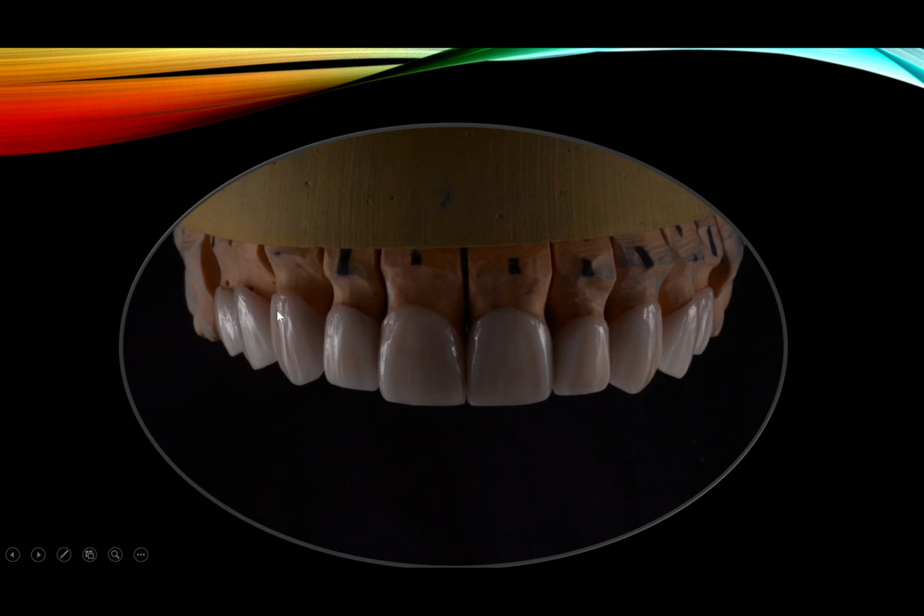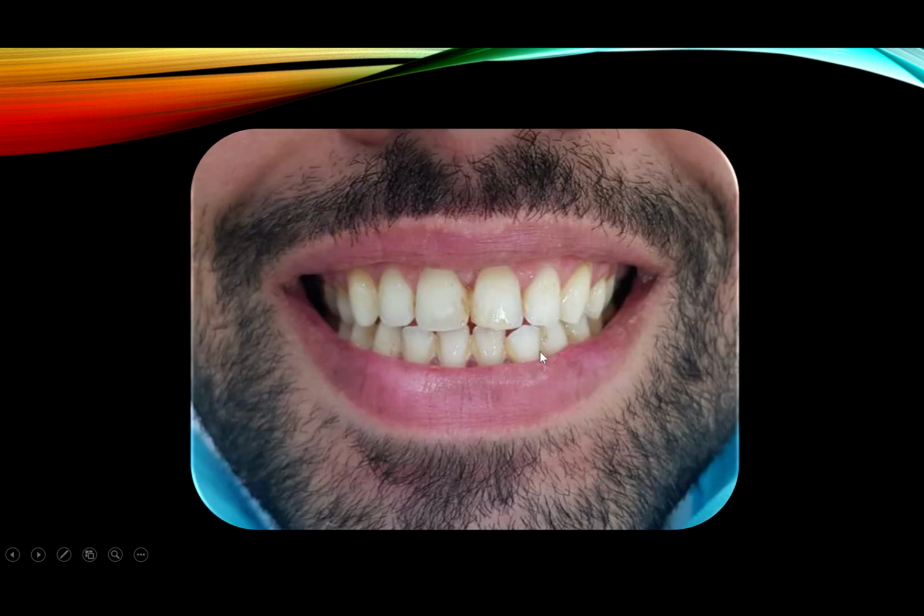These are lumineers, the very thin veneers that I talked about before. See how thin, you can see the gypsum materials underneath. This was 0.2 in many areas. All right. The overall was 0.3, 0.4, but in certain areas where I needed to make the canine look smaller, I had to go aggressive. So it was really thin.